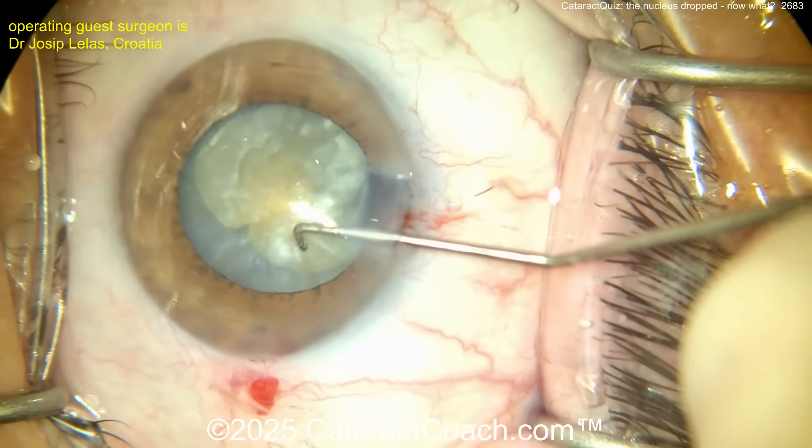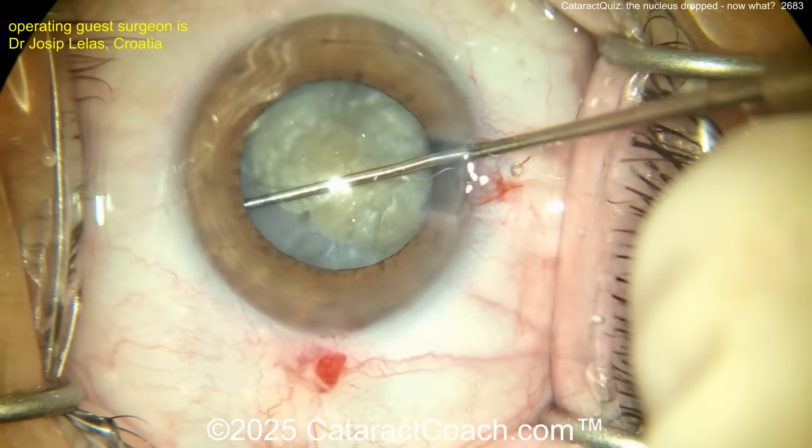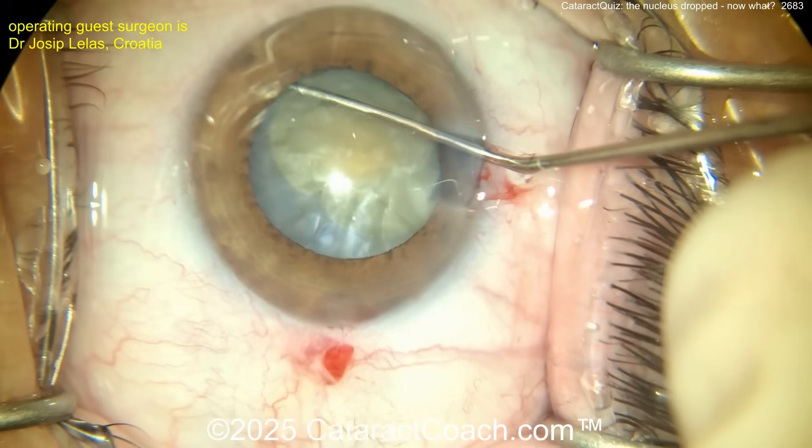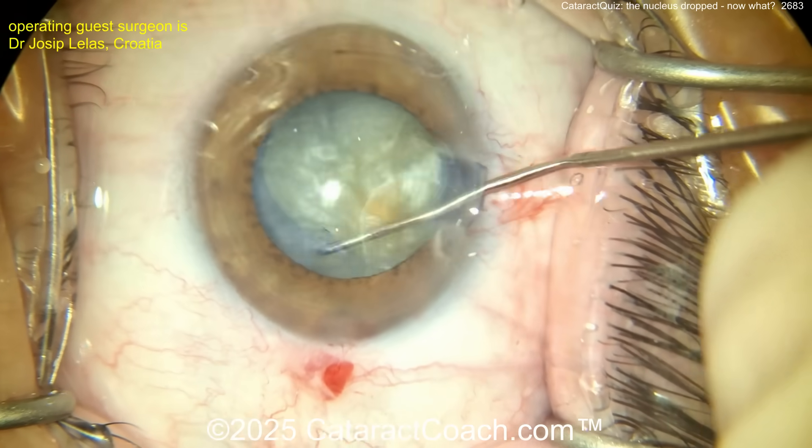We've slowed the video down — the beginning was at two times normal speed, now we're at normal speed. Trying to rotate it, and yeah, you probably don't need a whole lot of hydrodissection. A lot of times these patients with a white cataract with a liquefied cortex — they can spin right away.